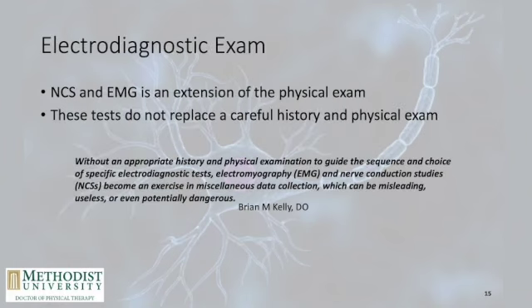This is a side note slide. Okay, so full transparency here. Obviously, just like with our physical exams, just like with the rest of diagnostic imaging, nerve conduction studies and EMGs are an extension of the physical exam. They do not replace the physical exam.